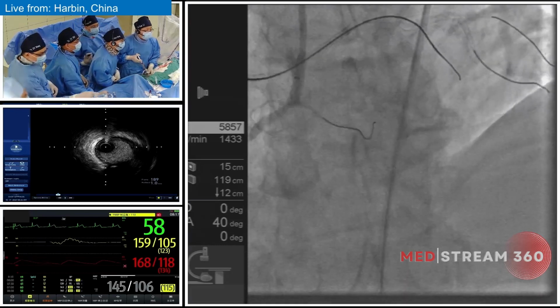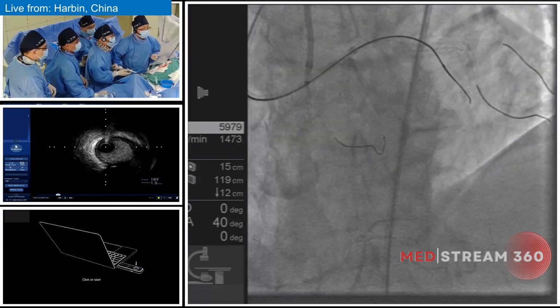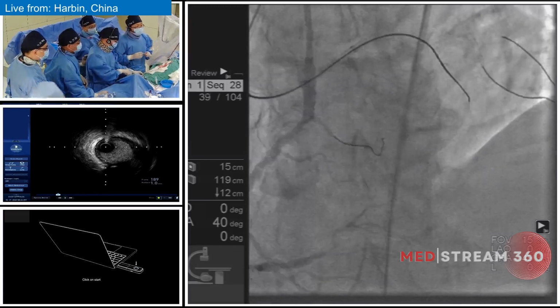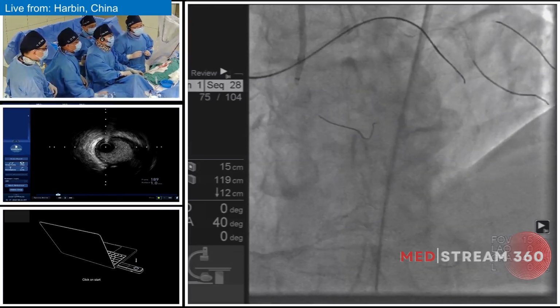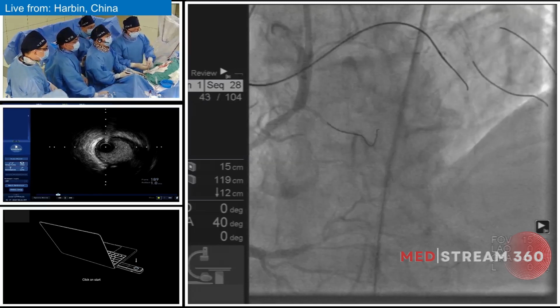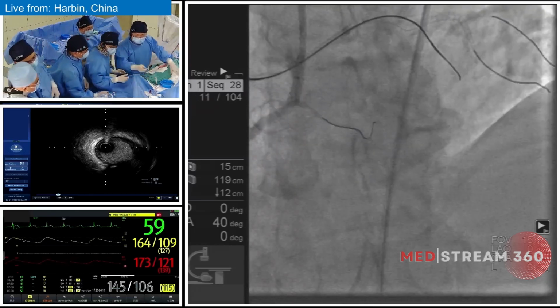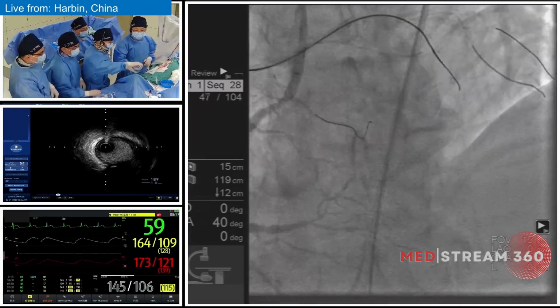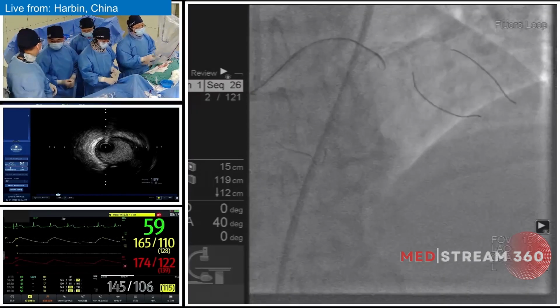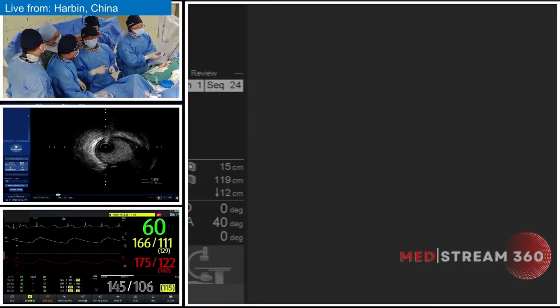However, we may notice that this dual lumen microcatheter failed to guide the antegrade wire into the true lumen, because we found from the CTO reconstruction information and the bilateral angiography that there is a very big proximal entry point, and also some calcification, which all raised the difficulty of the antegrade wire escalation.